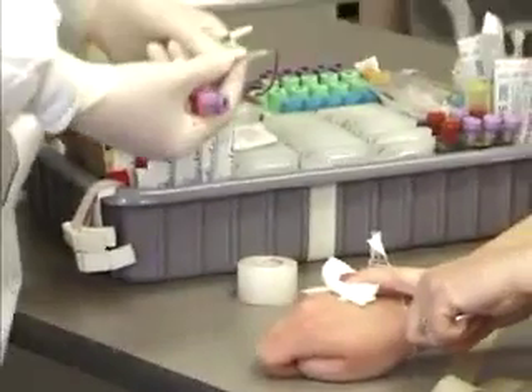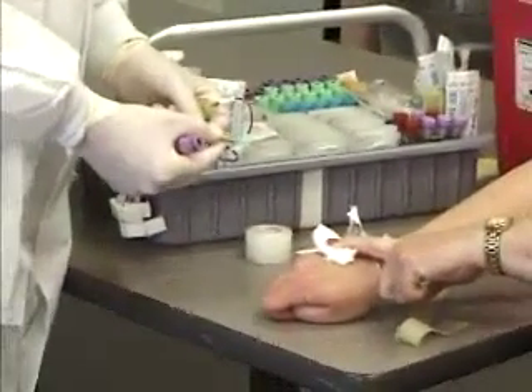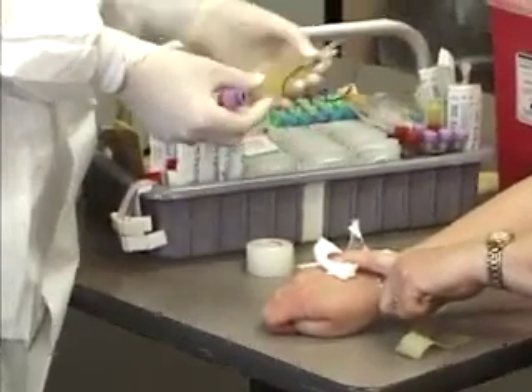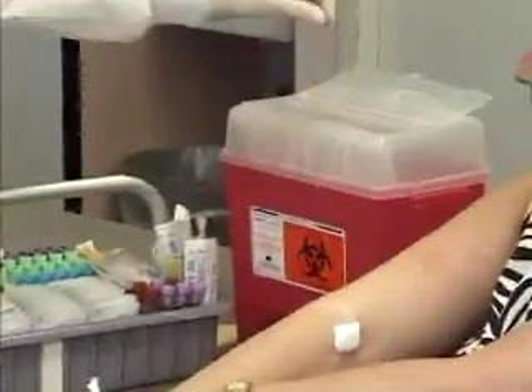You want to slide the safety device forward so that the needle is covered, and then you would dispose of the whole entire device into a contaminated box.